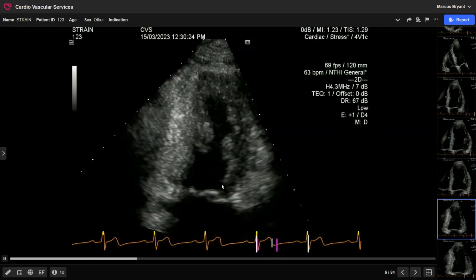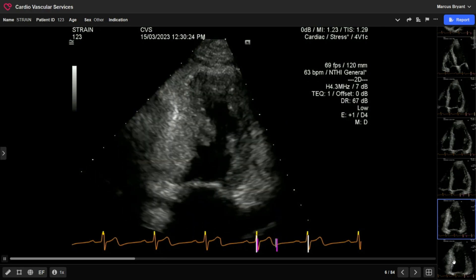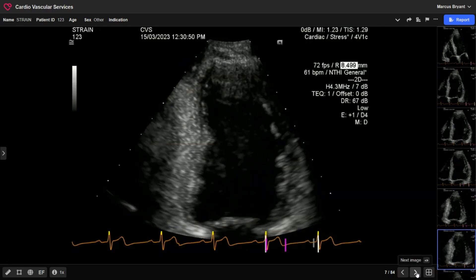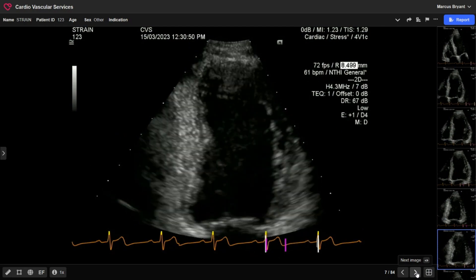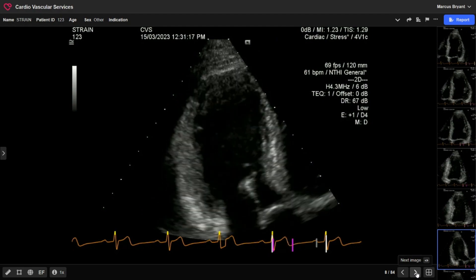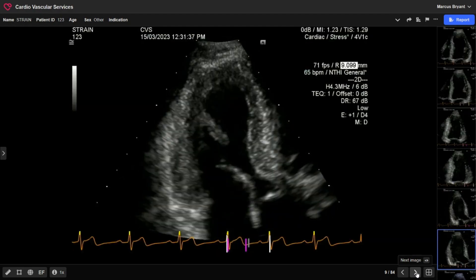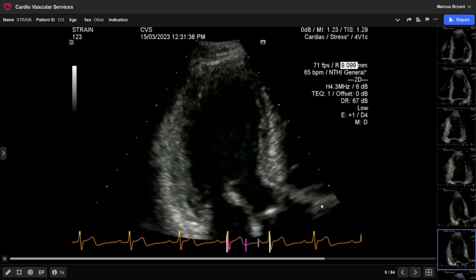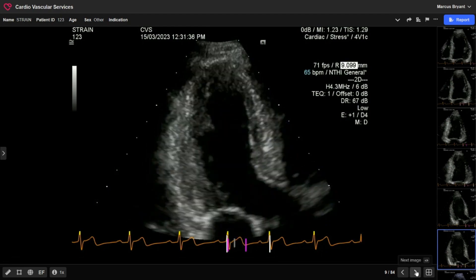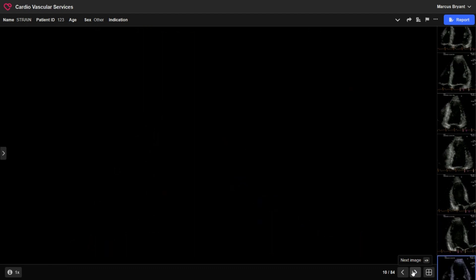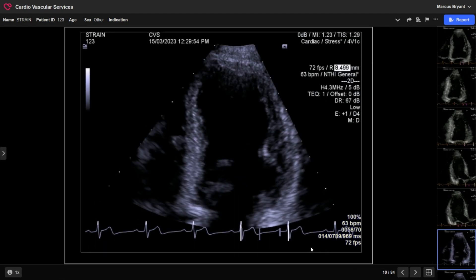Here I've got a two-chamber view where I've tried to include as much as possible, and here I've just zoomed in the same way to maximize the size of the image in the window. Similarly with the apical long axis, I've zoomed up on the image to maximize it. I could have gone a bit wider to really emphasize getting the epicardium in there, but for endocardial strain these four views are perfectly adequate.